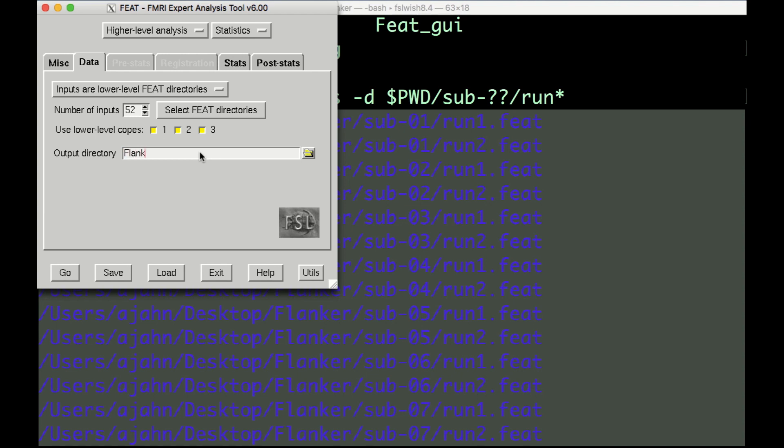In the Output Directory field, type Flanker Second Level. This is where the results of the second-level analysis will be saved.